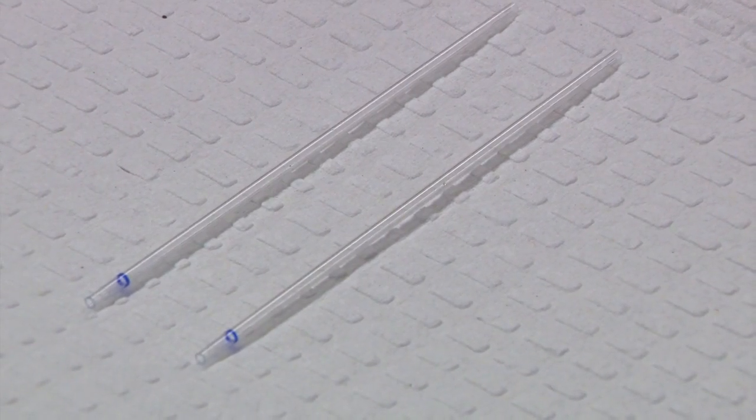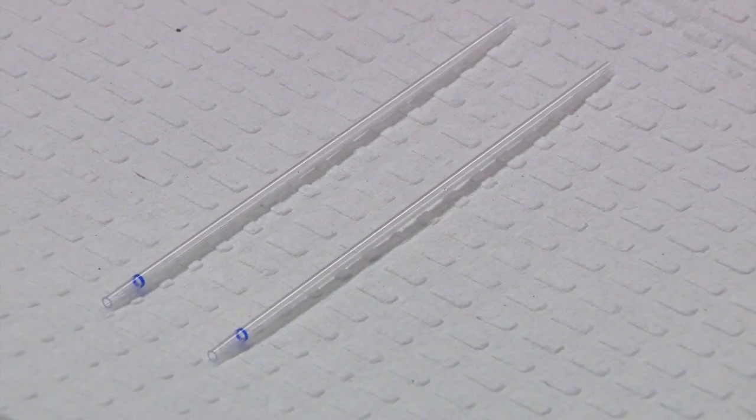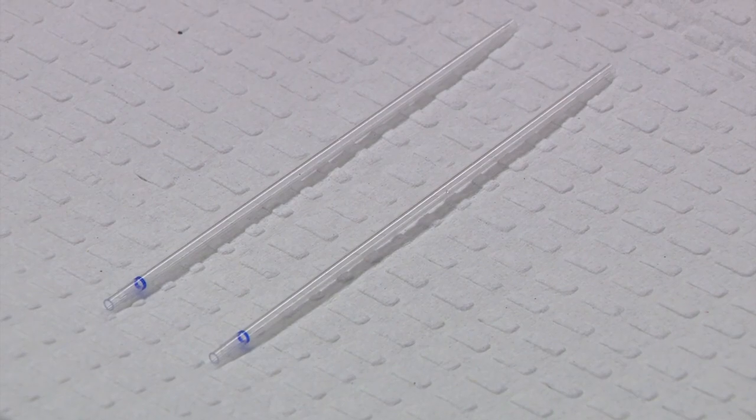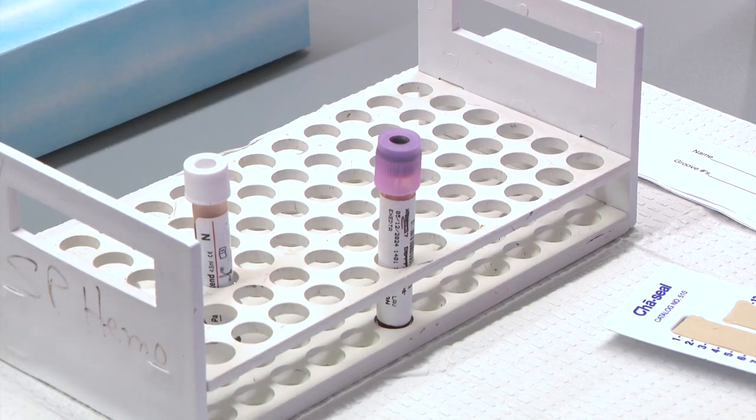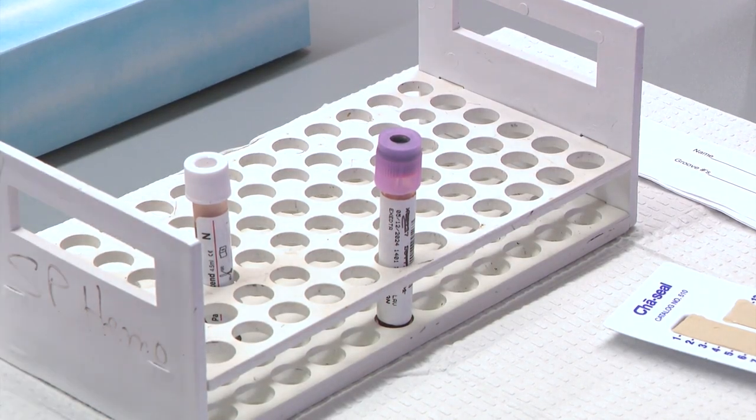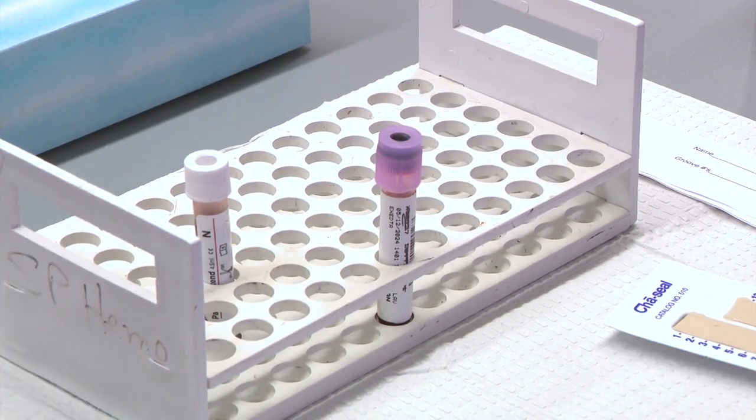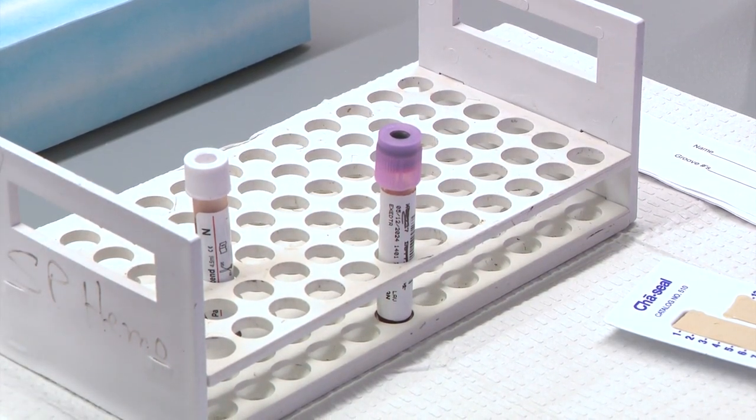The test is performed in duplicate, so two micro hematocrit tubes will be filled two-thirds full for each sample. We will begin by preparing the patient sample. While preparing the patient sample, make sure your control is set out so it can warm to room temperature.